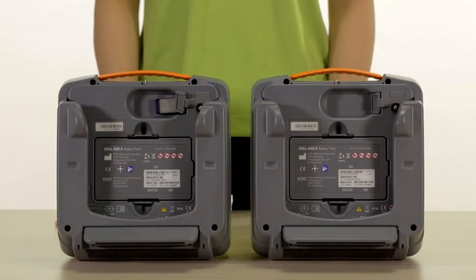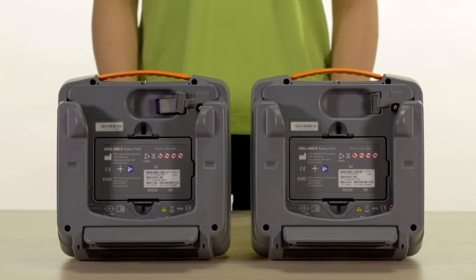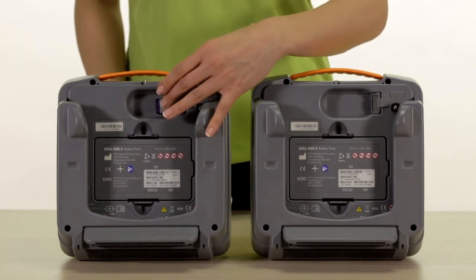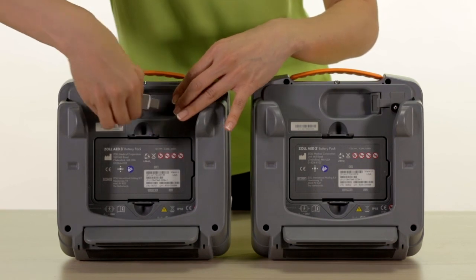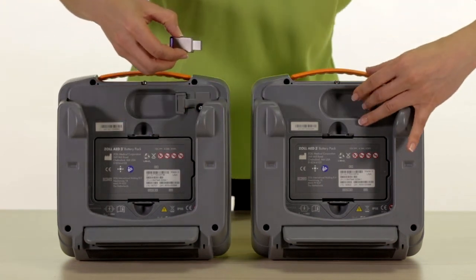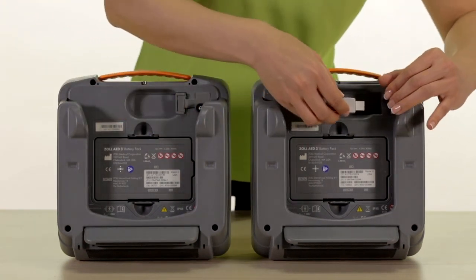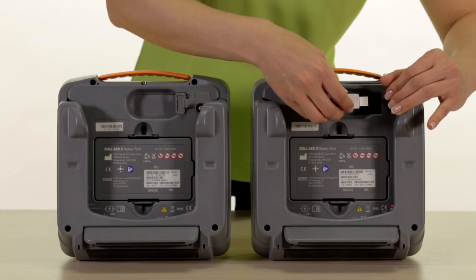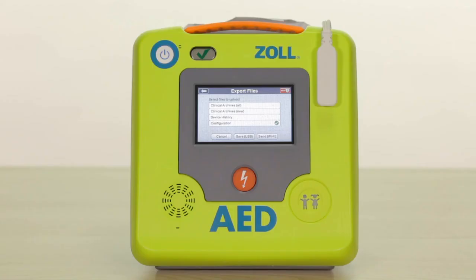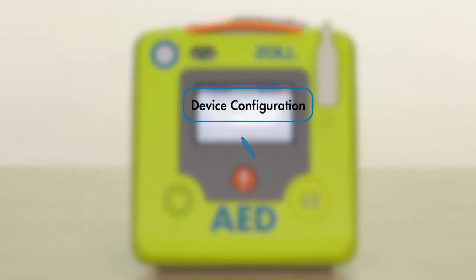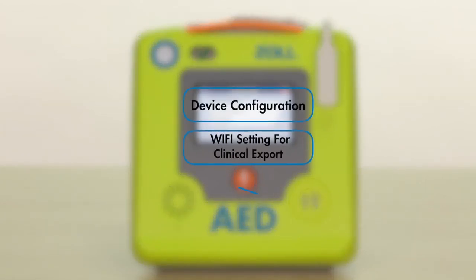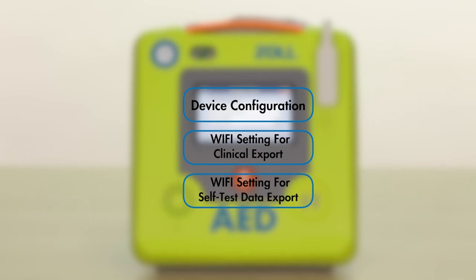As a convenience for larger fleets of AEDs, device configuration settings can be exported to a USB drive, which can then be inserted into another Xole AED3 device and uploaded to clone your configuration across all of your Xole AED3 devices. The Xole AED3 will export three configuration files: device configuration, Wi-Fi settings for clinical export, and Wi-Fi settings for self-test data export.